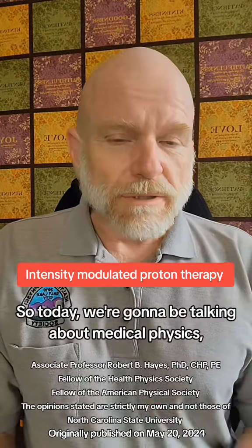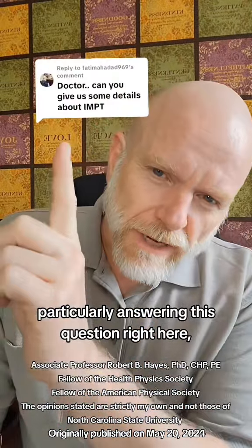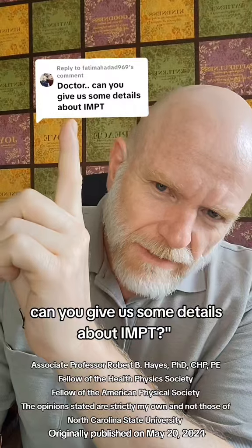So today we're going to be talking about medical physics, particularly answering this question right here. Doctor, can you give us some details about IMPT, or intensity modulated proton therapy? Now, with proton therapy, what you do is you accelerate the protons to a really high energy. So like a pencil, you can trace out a tumor.